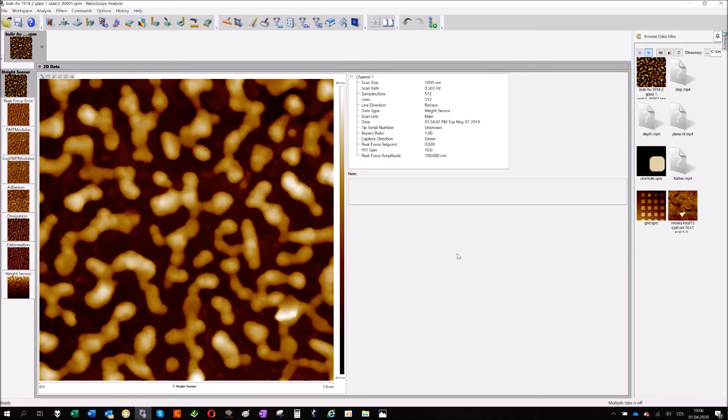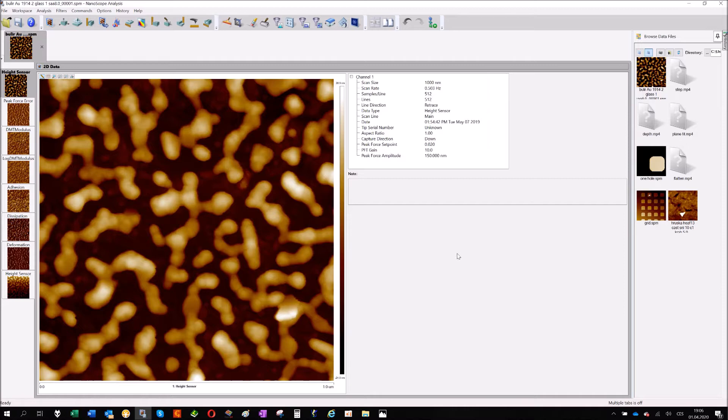Hi everybody, my name is Vladislav and I'm here today to tell you something about AFM images export and visualization of data.